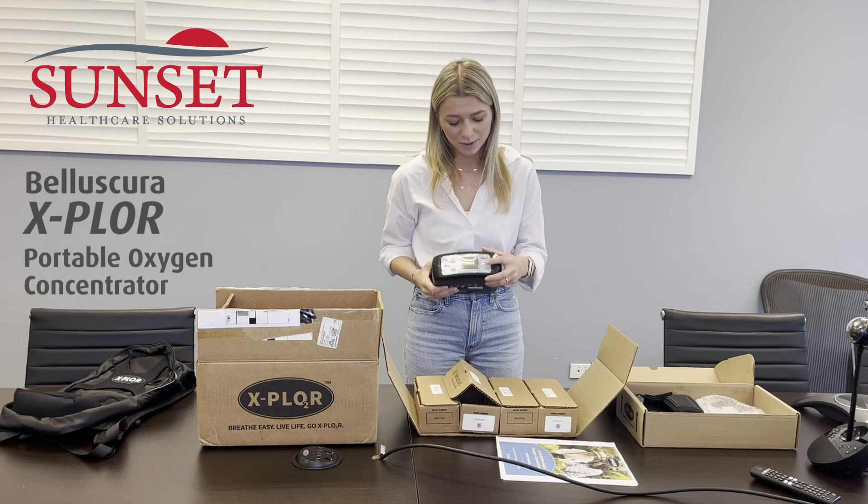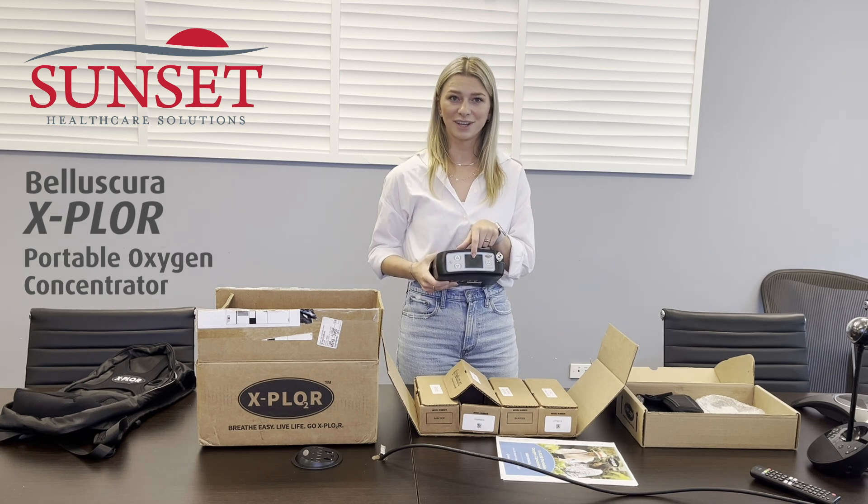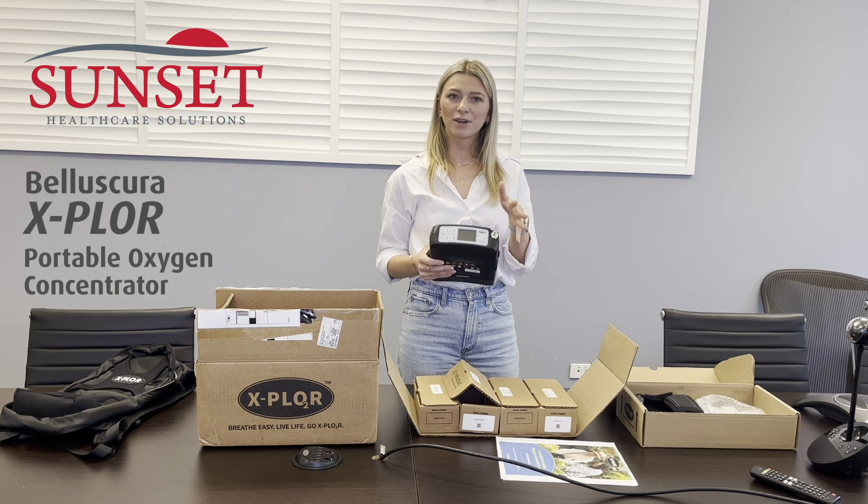To turn off the unit, you would just press and hold this button for about three seconds until the power icon shows up on the LCD screen. It'll take about 20 seconds to fully shut down after that.